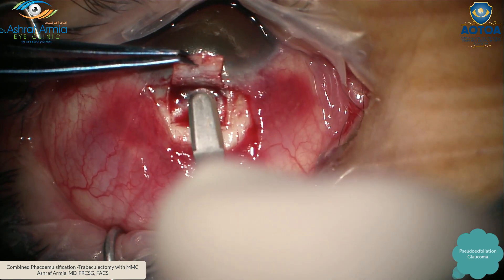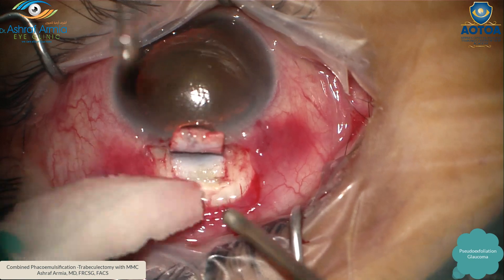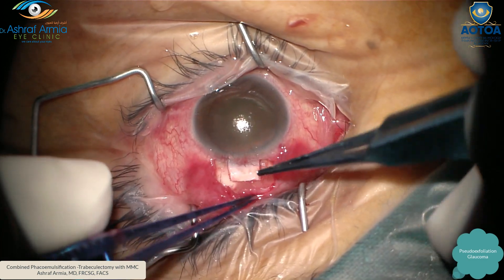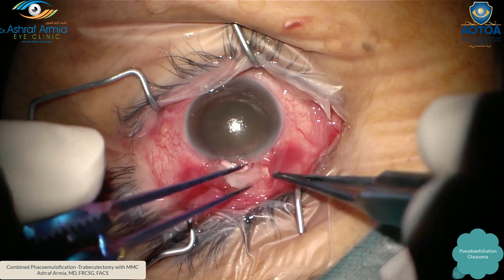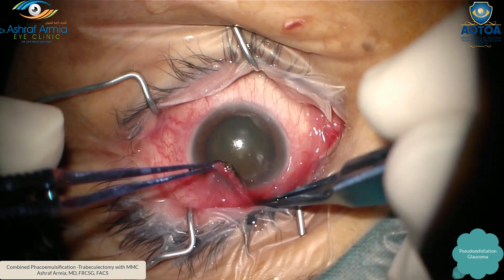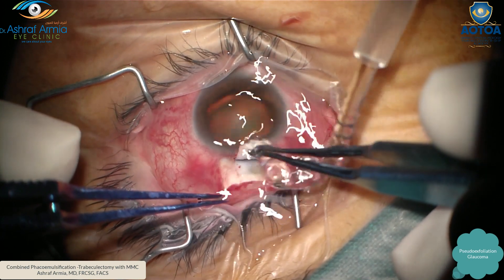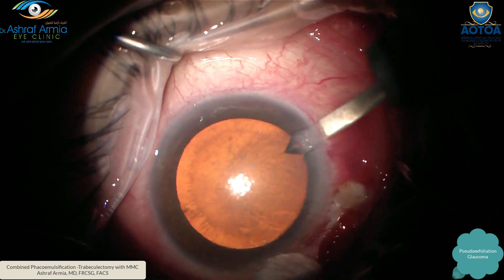Continue dissecting until you reach a clear corneal area — this is very important, don't stop unless you see a clear corneal area after the blue zone. Then cut, rise, and leave it like this. With mitomycin 0.2 for two minutes, I put the sponge inside the conjunctival pocket that I made, then wait for two minutes. After you finish, remove the pieces and irrigate the pocket very well.